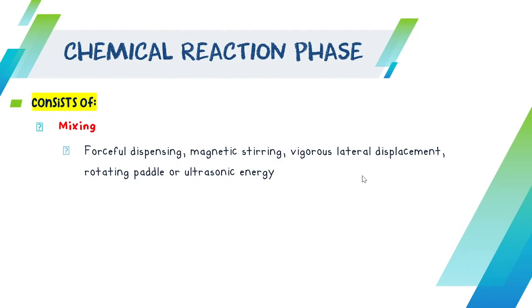Now, regardless of the step, actually, one of the hardest to automate is the mixing part. There are some machines that are very good and very transparent, where you can really see the overall process. There are some machines where the style of mixing is they just vibrate, something like that. But then again, I mentioned your hematology analyzers, where the mixing is literal, sometimes like a loop of 8 or sometimes an upside down style. So that is also done.